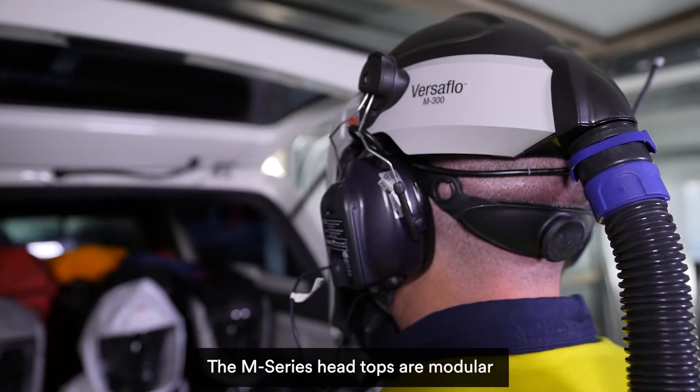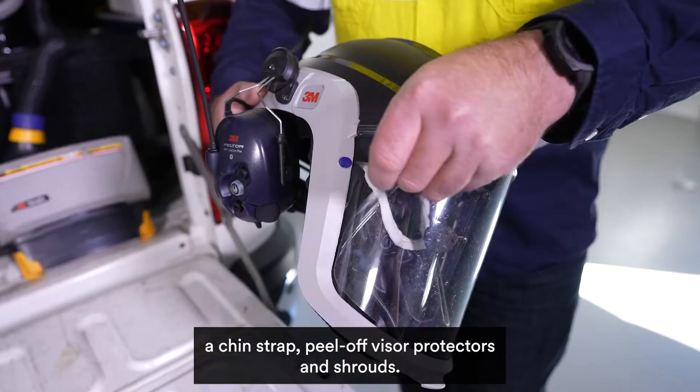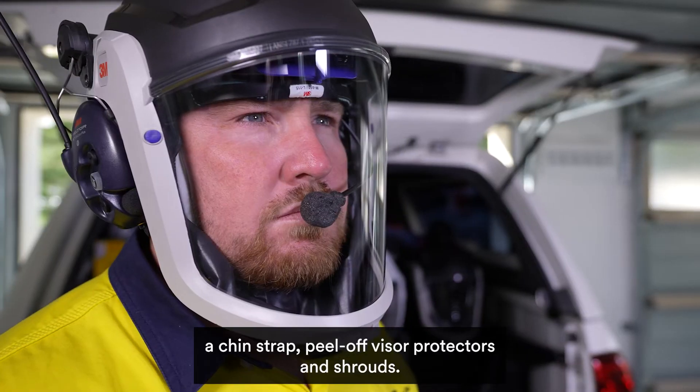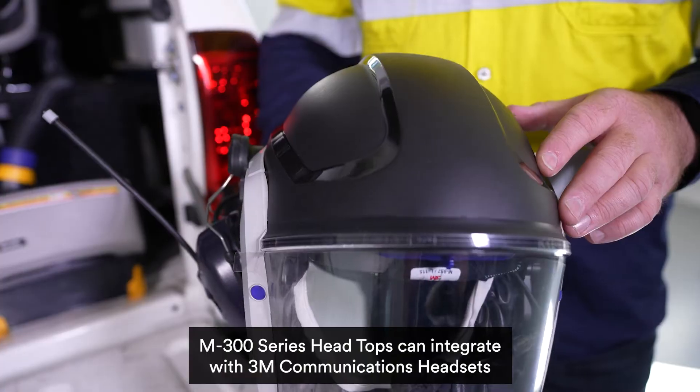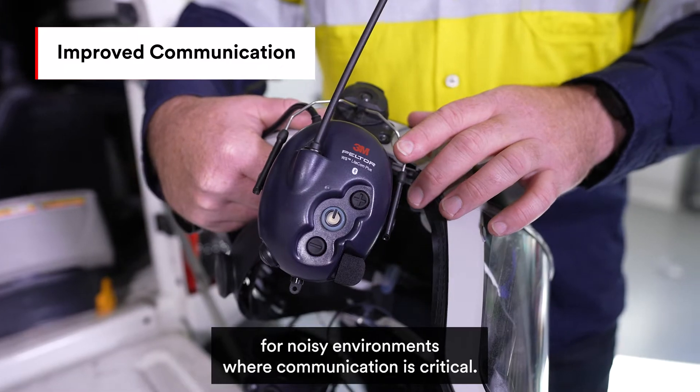The M-Series head tops are modular, allowing the attachment of various accessories including earmuffs, a chin strap, peel off visor protectors and shrouds. M300 series head tops can integrate with 3M communications headsets for noisy environments where communication is critical.